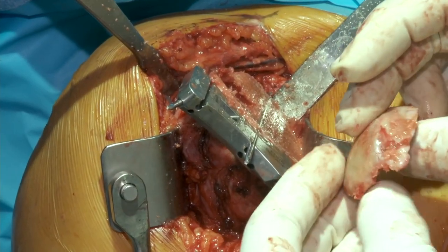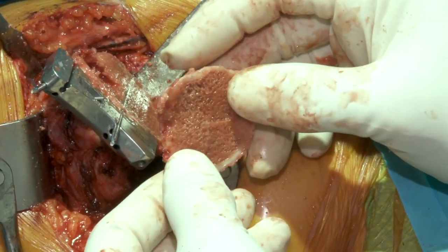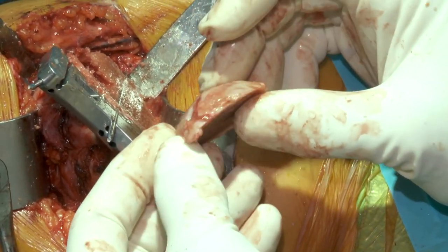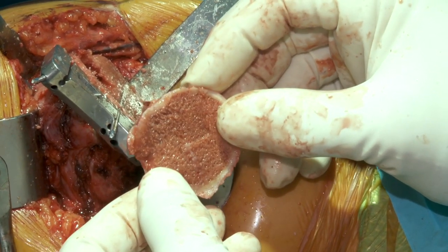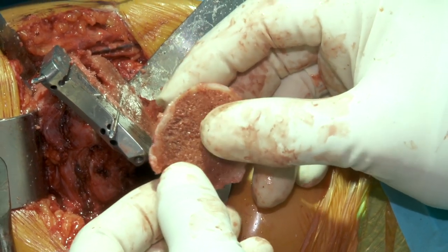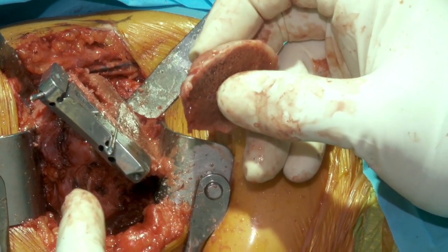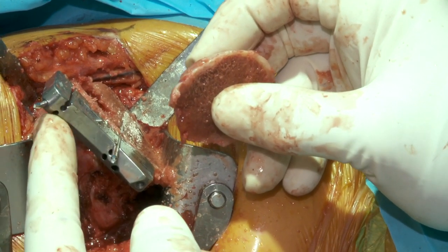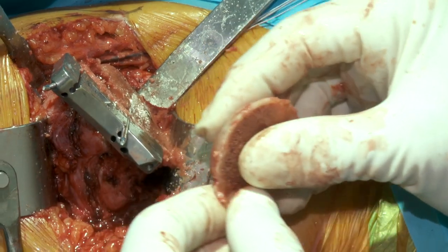This humeral head can be used as a bone graft. If we saw in our preoperative x-rays that there was a defect in the glenoid, oftentimes this segment of the humeral head fits very nicely exactly in the defect. We don't see a defect on the glenoid, so we won't need it for this case. But in cases of primary cuff tear arthropathy, it's not unusual for the humeral head to erode superior and posterior, and oftentimes the humeral head makes the best graft to fill that defect.